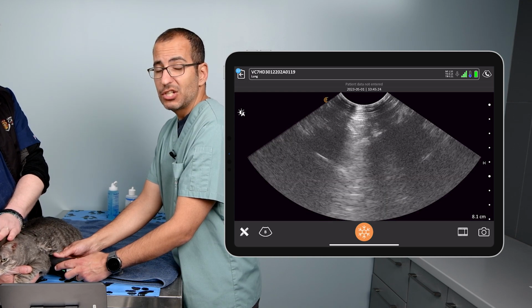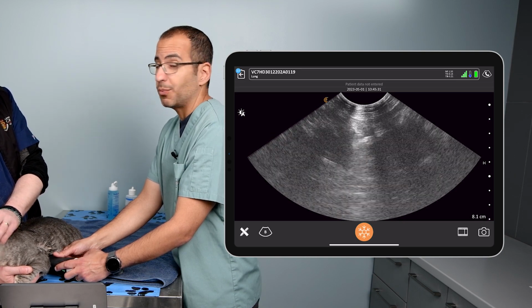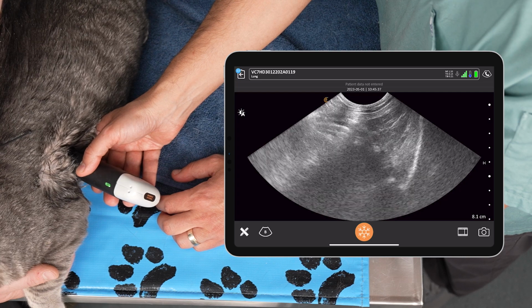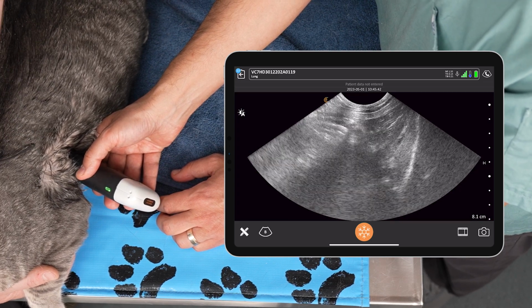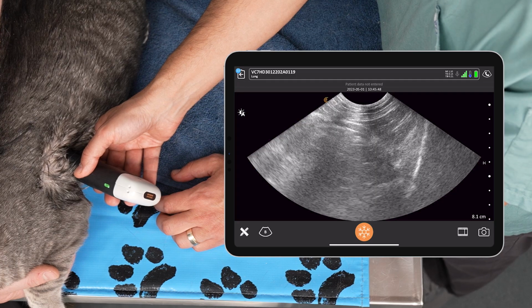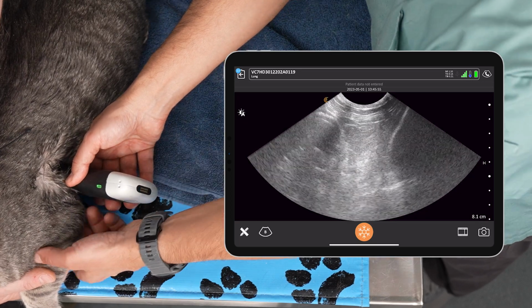And then I can finish my scanning of the ventral areas looking for alveolar interstitial disease. Usually what we could do though at this point is rotate the probe parallel to the ribs. So we're going to go ahead and do that. So we're parallel to the ribs. It's important to know your anatomy on here. On the right, we're going to have the sternal muscles. On the left, we have the lung, and we can see the glide sign there. Absolutely. I see no anechoic fluid separating the sternal muscles from the lungs ventrally, which would suggest pleural effusion. And I saw no B lines or shred signs or consolidations to suggest that we have actual lung surface pathology here.